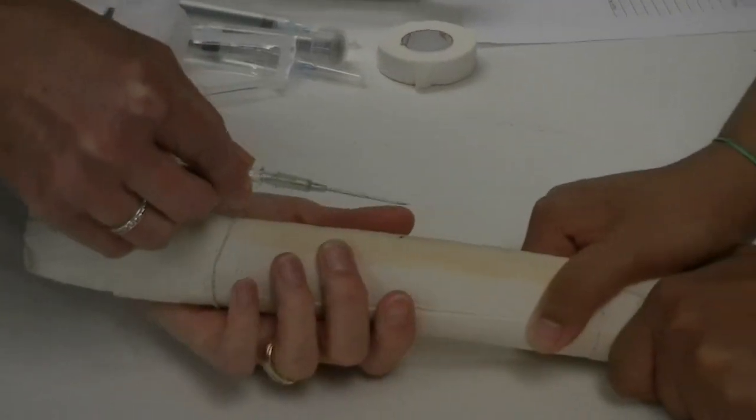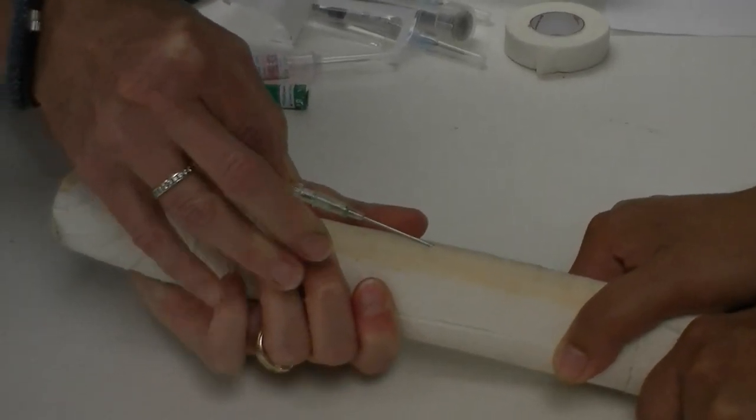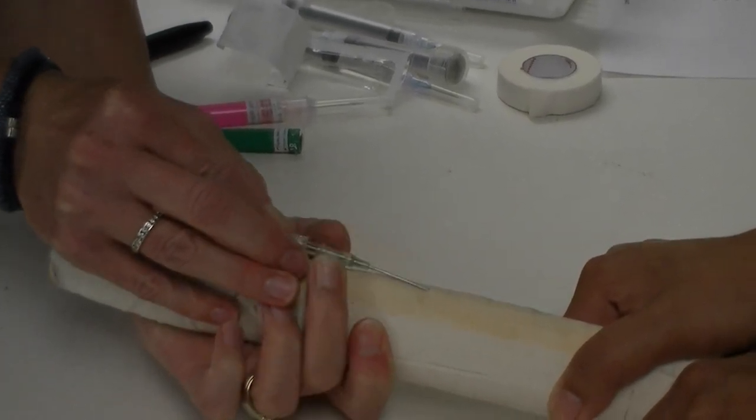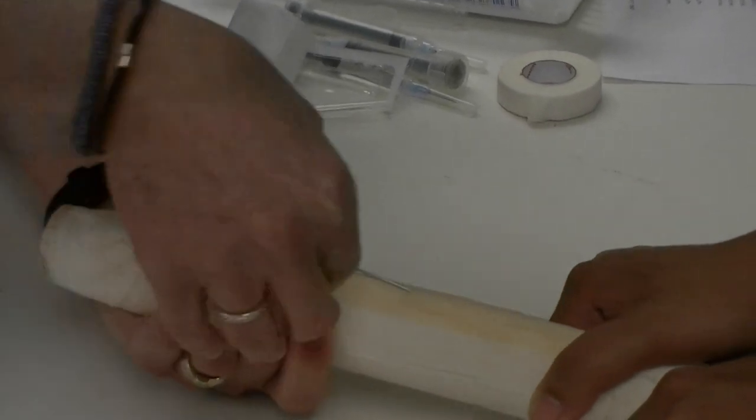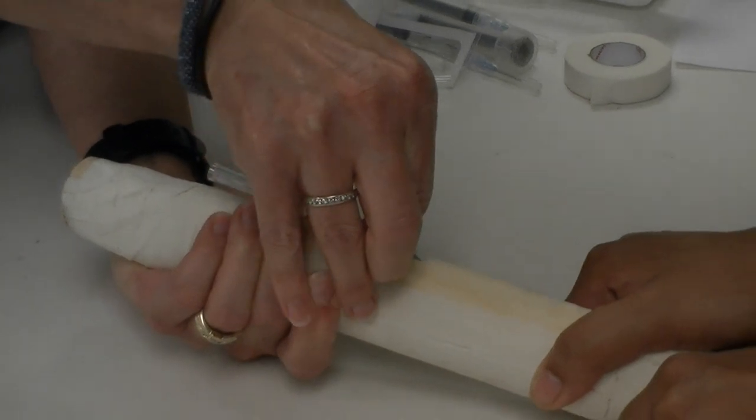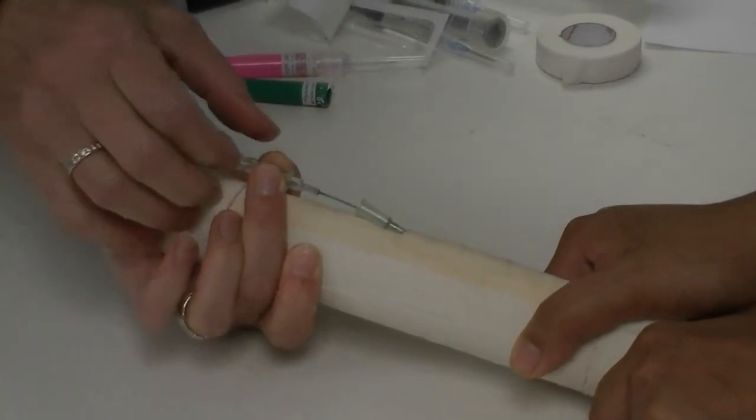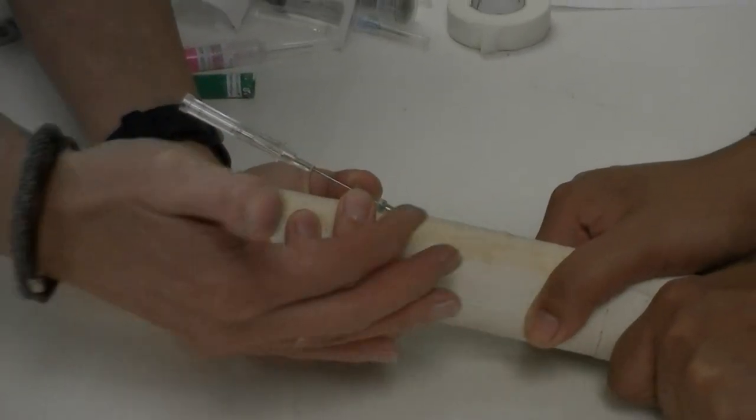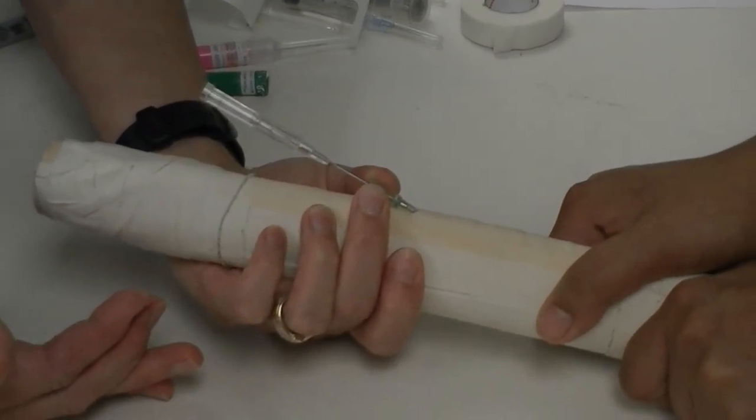All right, so we'll do that one more time. Holding the limb, getting it through the skin, finding the vein, seeing the flash, changing my hand position, pushing the catheter off the stylet all the way to the hub in the skin here.